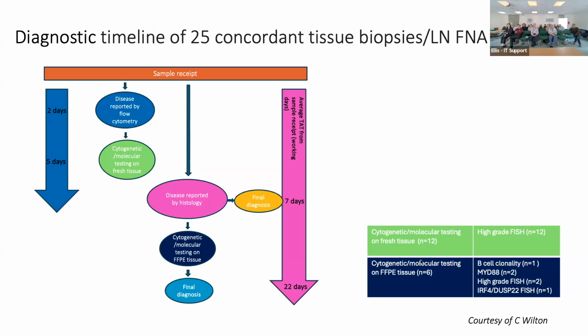But if your samples are running in parallel, by the time you get your H&E and or immunos out on the sample within CUH, you have your FISH results back. You can sign it out. It's not on my shelf, I'm not waiting for the GLH, no one's bothering me. It's signed out within a reasonable time frame.